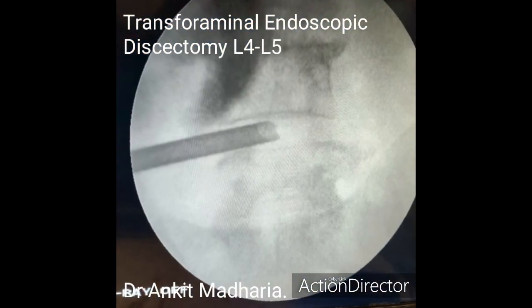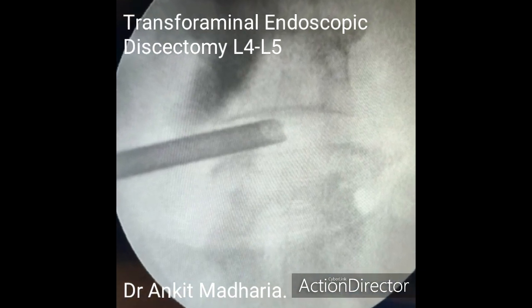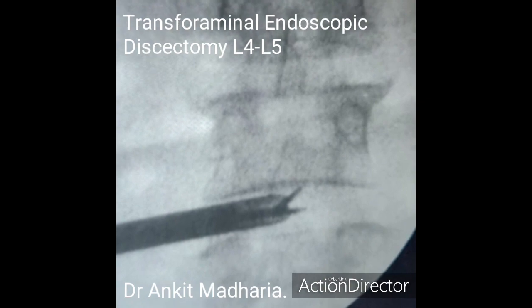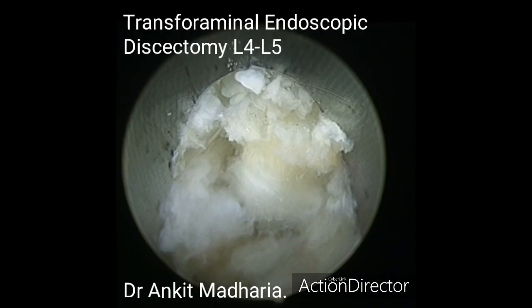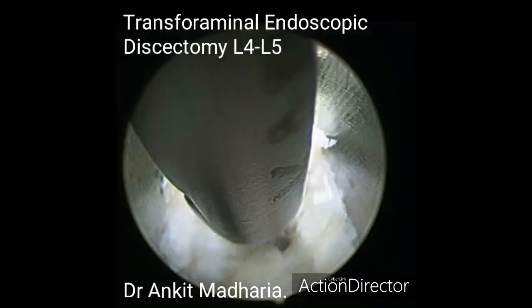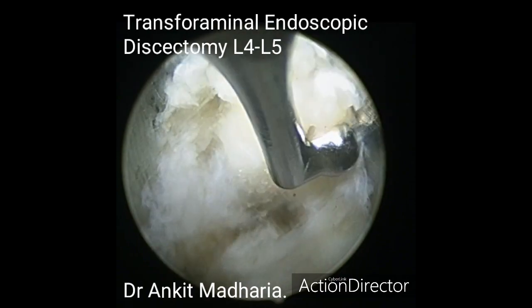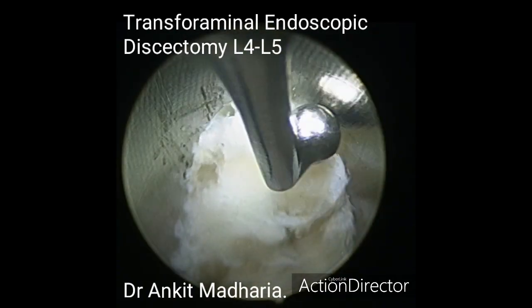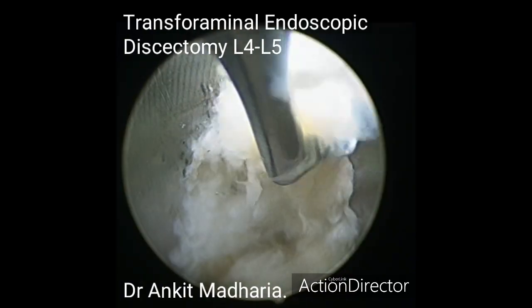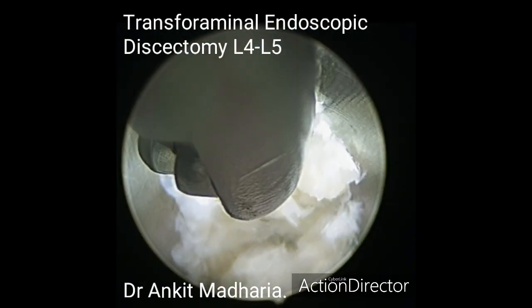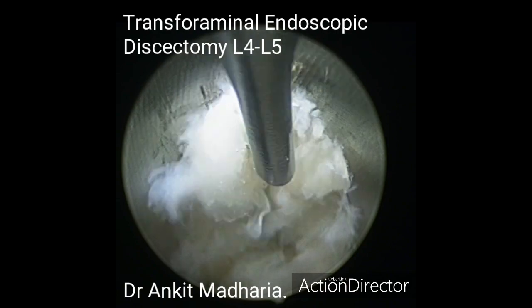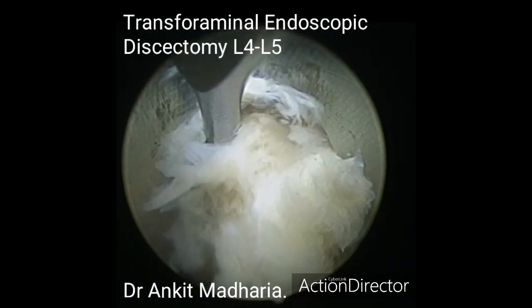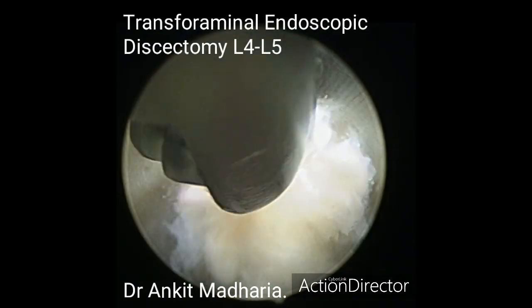An endoscopic portal was created at the level of L4-L5 on the left side. The inside-out technique was followed and intradiscal decompression was started. An endoscopic articulated hook was used to tease out the degenerated nucleus into the working channel. The degenerated nuclear tissue was extracted using a grasper.